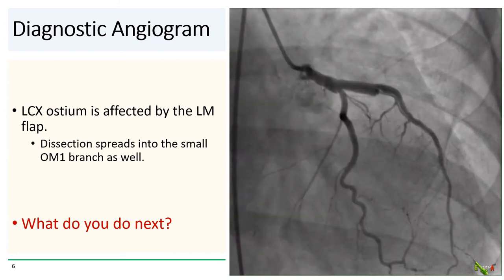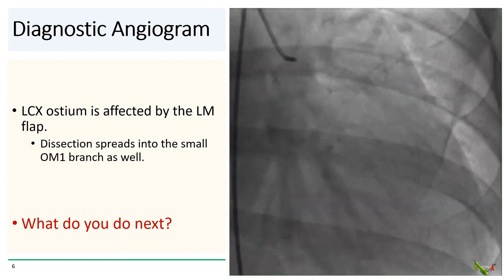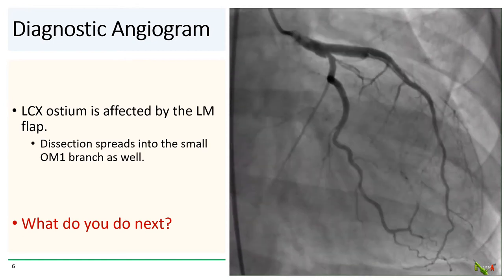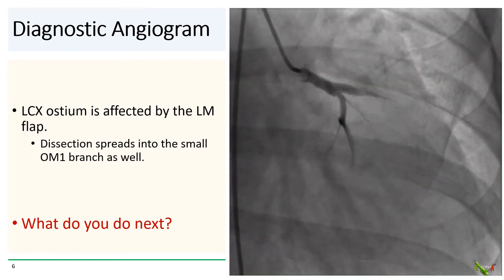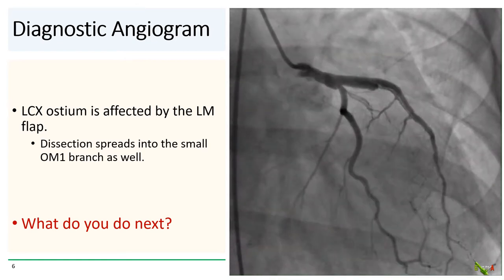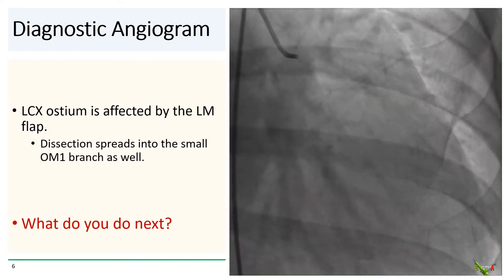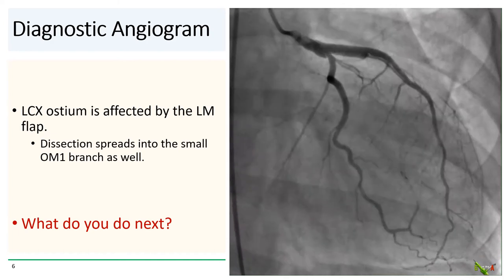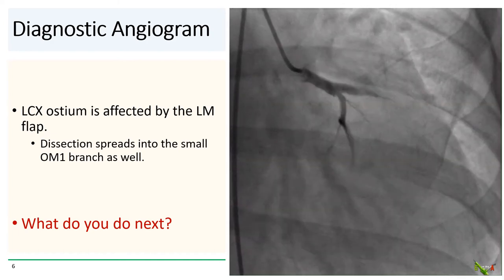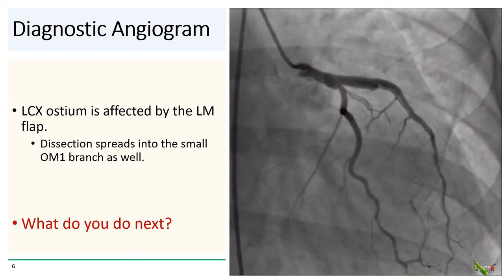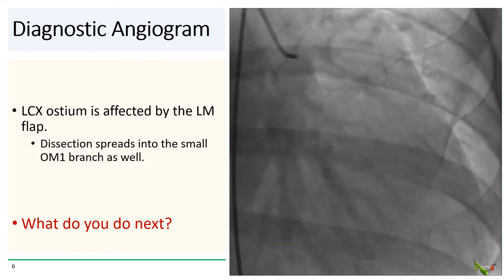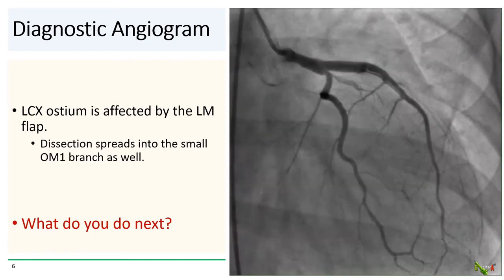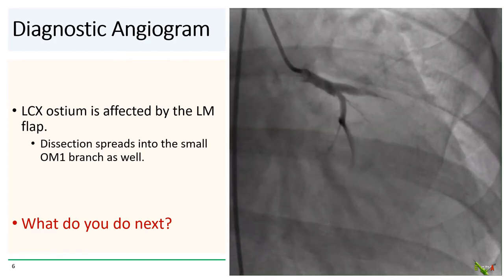The circumflex is affected as well. Its ostium appears partially compromised by the dissection flap in the left main. You can see that the dissection spreads all the way down into the small first OM branch as well. In this view, you can also see that the dissection in the LAD actually reaches up to the mid-LAD. But again, fortunately, there is still TIMI-3 flow in the circumflex.